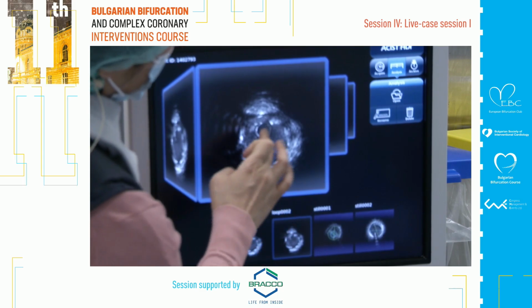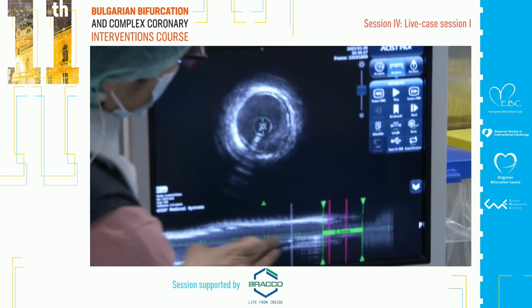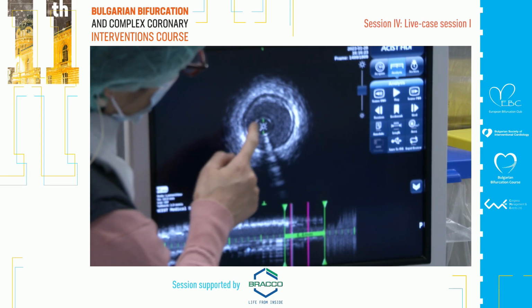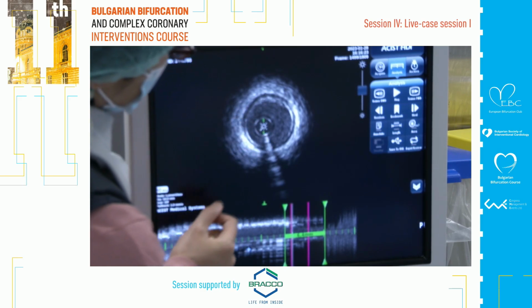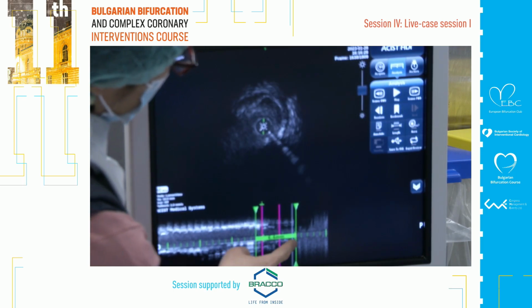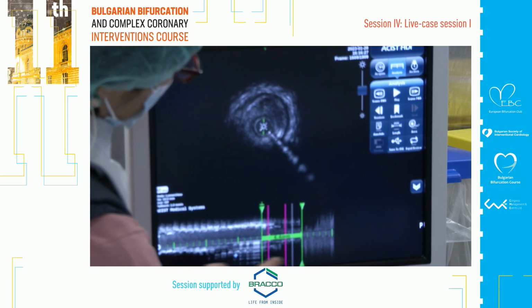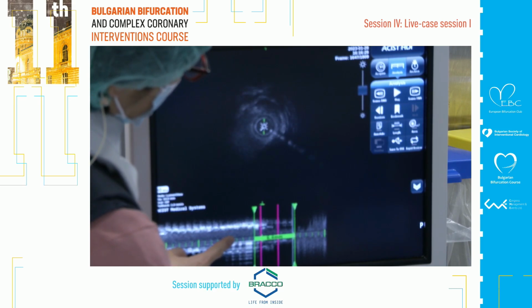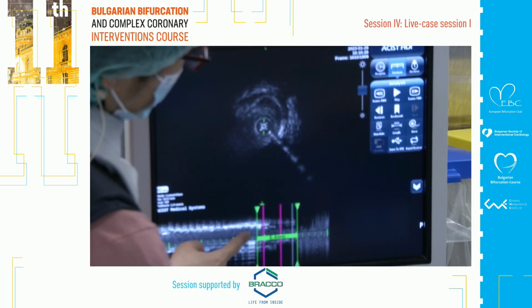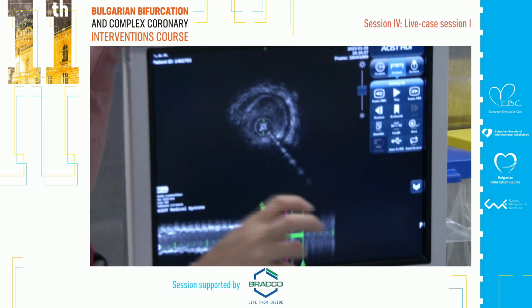stenosis in the ostial coronary artery, but I do think there is the very thickening of the media. When I stop here, you see the media is thicker than usual. That's indicating some sort of spasm. But even if I go to the ostium, it's very tight, and if I measure the area is, okay, looks like it disappeared. Anyway, it's very tight, and very soft plaque, and only the focal, and only the ostium.